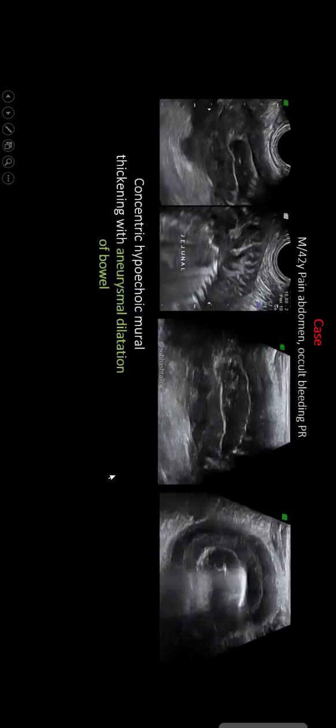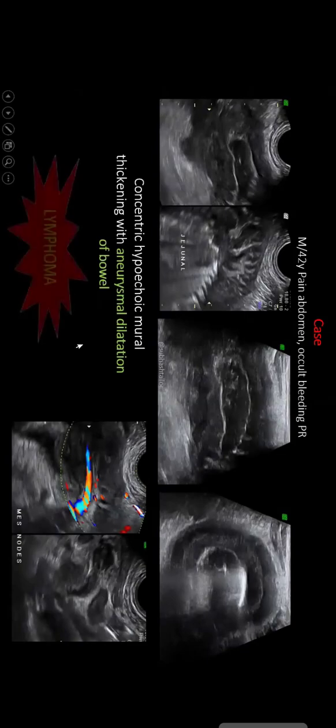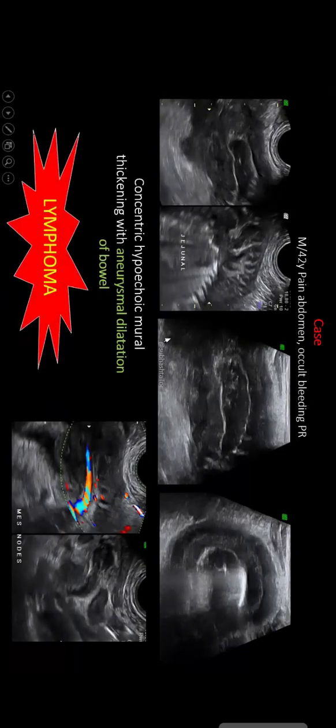Aneurysmal dilatation is a significant feature, with associated lymphadenopathy in the mesentery, a case of jejunal lymphoma. Another: fat reaction, small segmental jejunal lymphoma. There is concentric thickening, lumen is preserved or rather aneurysmal dilatation, with a large mesenteric rounded node. This is a pediatric patient, male 10 years. See a small segment of jejunum, focal jejunal mass, concentric mass with node.